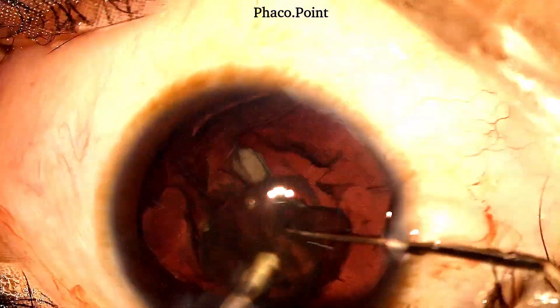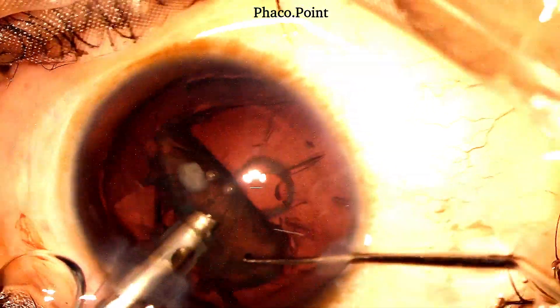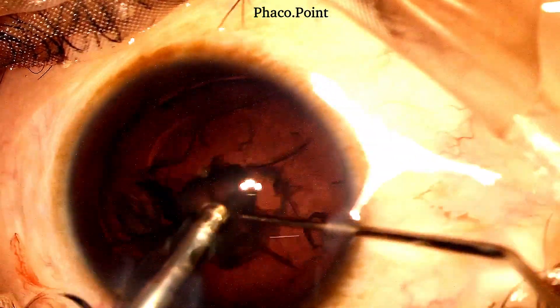This is an extremely soft cataract and it is going to be emulsified in the epinucleus mode settings. The endonucleus is impaled with the phaco probe, brought up into the anterior chamber, after which it is aspirated.